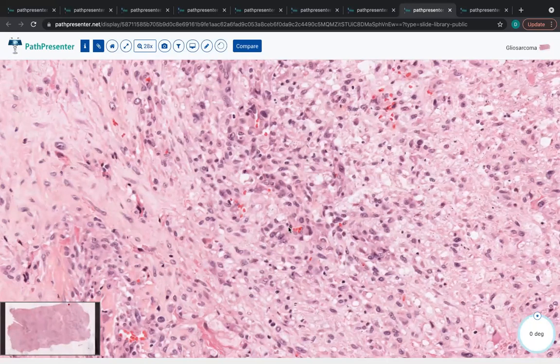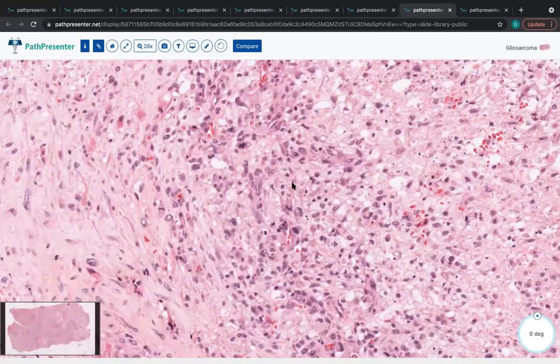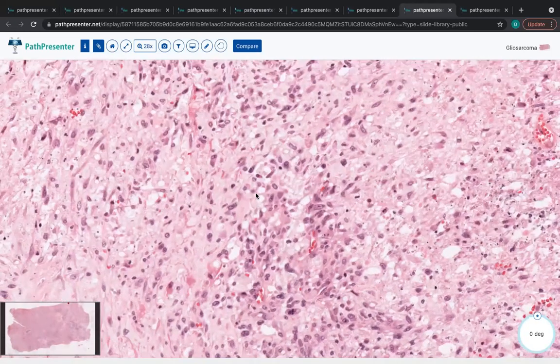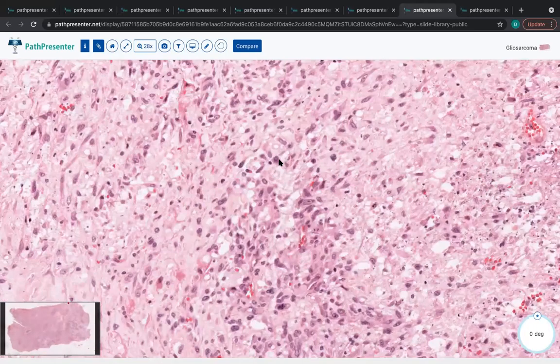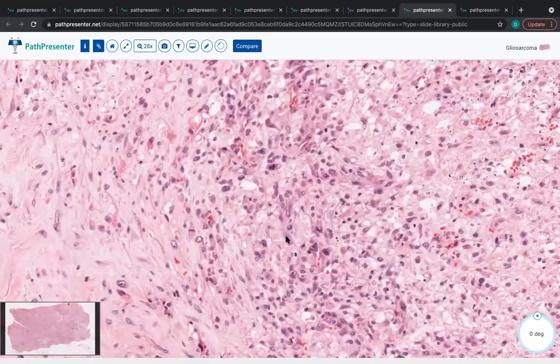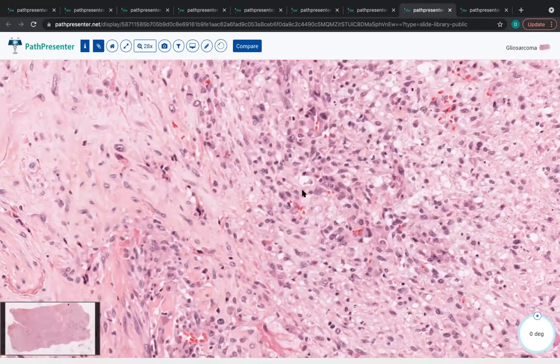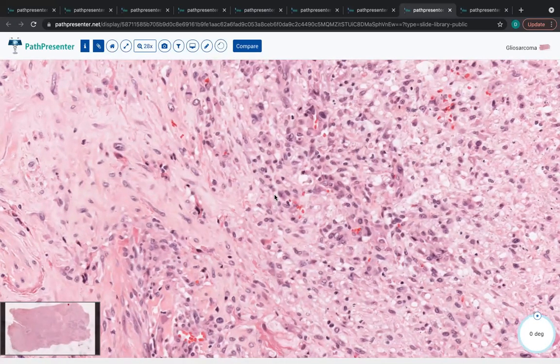As most glioblastomas can have fairly varied morphology, there is no standard given morphology to the glial component of these tumors, other than it just looks more obviously glial than mesenchymal. And if one is doing a reticulin stain, those would pop out as being in the reticulin deficient regions.